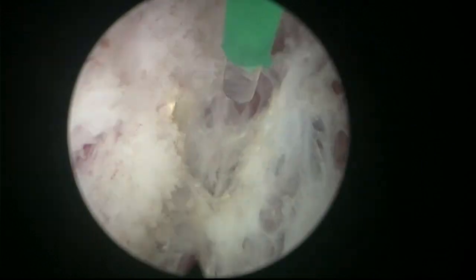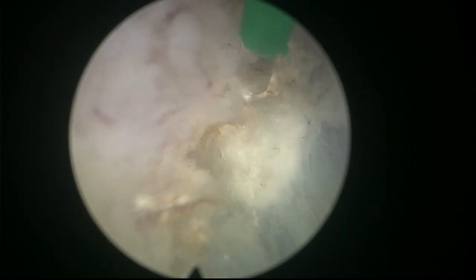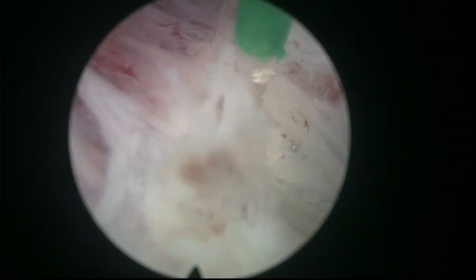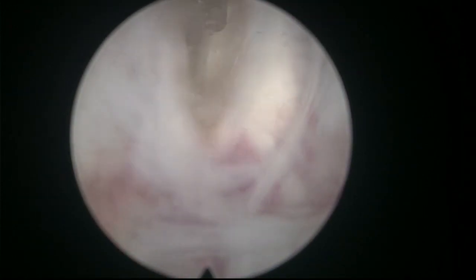Here we are seeing a different kind of plane. You see, it's a little bit spongy, so maybe we're getting into the peripheral zone. But it looks like a good plane to me, so I'm going to follow, just being a little bit more careful in that area. You see that we must now be arriving at the equator of the dissection. So from now on, the angles are going to change. We are dissecting an almost spherical adenoma. Initially, the angles are opening towards the external, towards the lateral, towards the anterior, and towards the posterior. And now we need to close these angles by pointing the fiber a little bit closer to the adenoma, you see? Keep it close to the adenoma, so it dissects the plane, but it has very little chance of damaging the capsule.